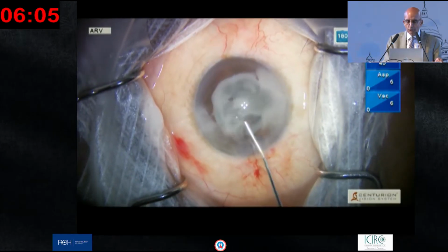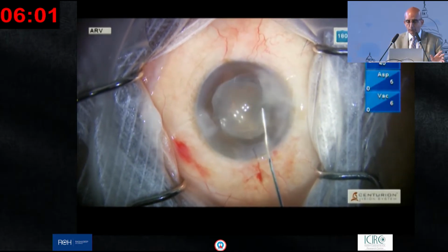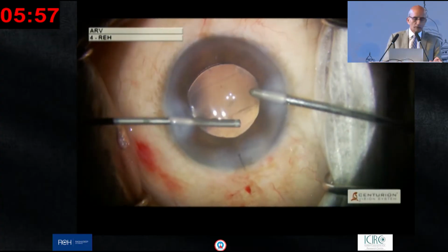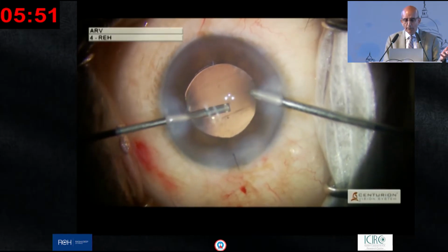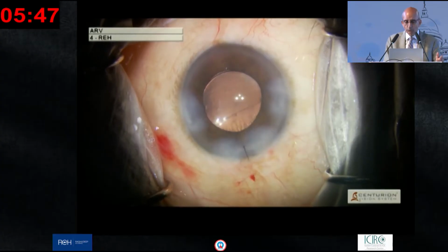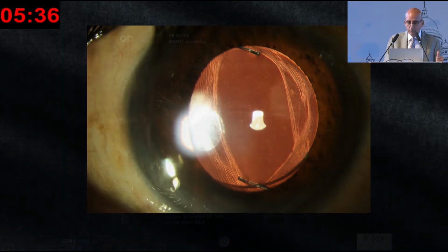We need to suture this lens because this was almost a 4 millimeter incision, 3.5 plus. I always make sure that vitreous is not there. I'm using vitrectomy here to remove things because we already had it out thinking that we'll need it. We never needed to use it, but I am justifying its presence on the trolley. So that's how it is, and at the end, after a few days, this is how it looked.